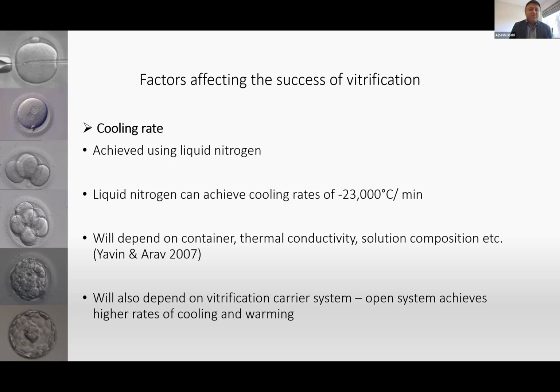Of course, the composition of the solution will have an impact on the cooling rate. But there are various pointers around how to optimize your cooling rate. One of them depends on the carrier that you're using, whether it's an open system or a closed system, what the thickness of the plate is on which the carrier sits, and so on. So again, many factors add to the success of the cooling rate.